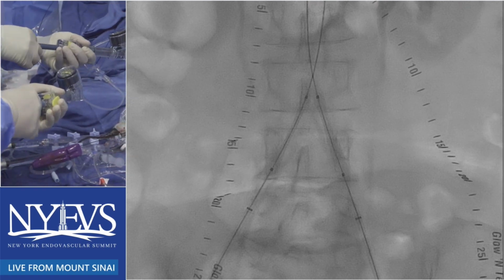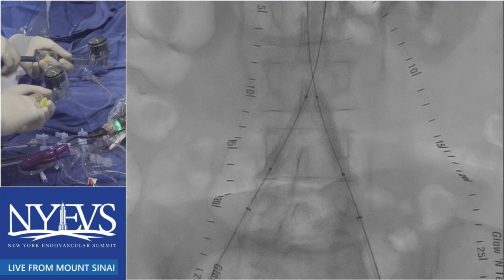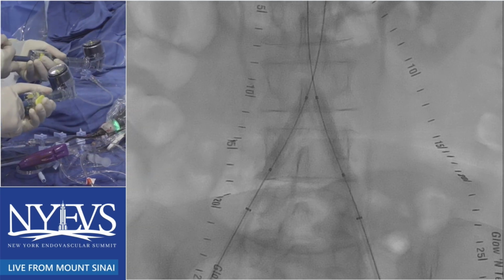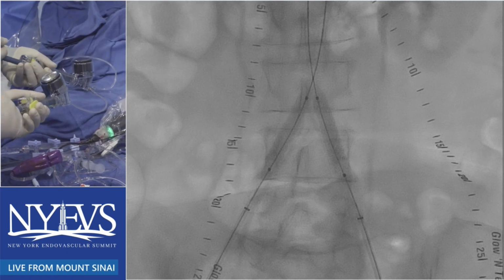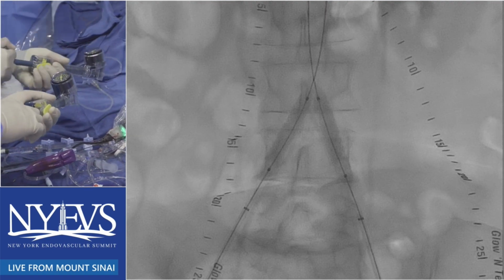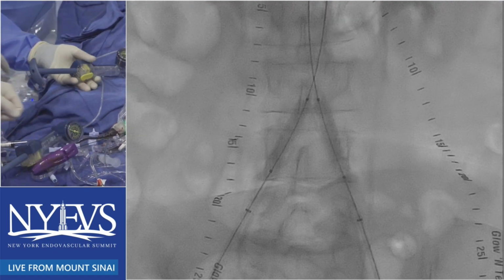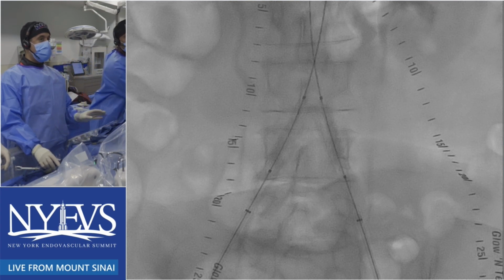Yeah. And I don't think it makes a difference. I don't want them crossing. I don't want to cross them over, but you can extend it 5 millimeters without the stents crossing. That's exactly what we did. We just extended 5 millimeters into the aorta because it looks like the distal aorta has some calcification also. And even at that distance, you can still cross over the aortic bifurcation. Yeah, easily. Absolutely. That angle is totally fine.